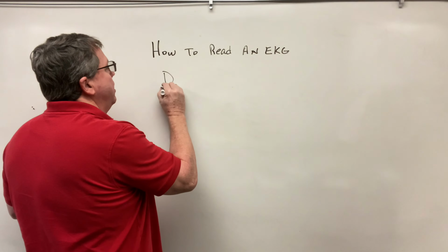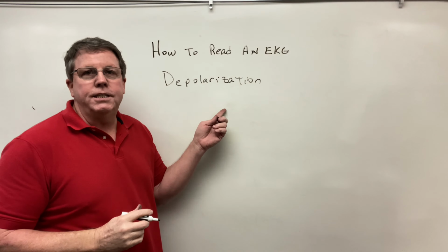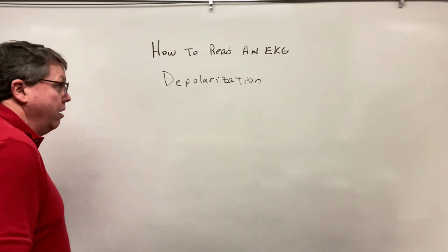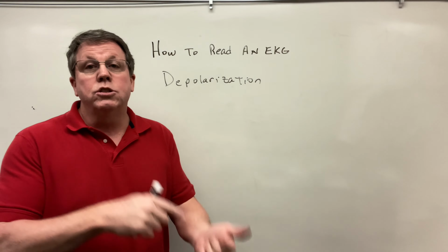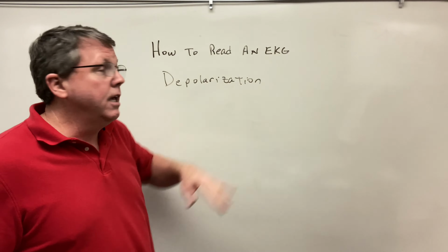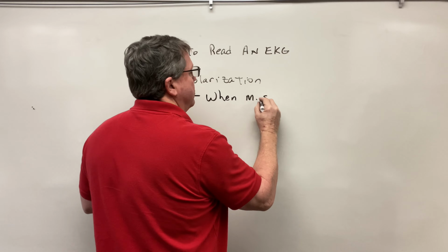And the first one is the term depolarization. When nerves undergo depolarization, sodium rushes in, and then at a certain point, potassium rushes out, and that's repolarization. So when we're talking about an EKG, the depolarization is basically going to be when muscles contract. Okay, when the heart muscles contract.